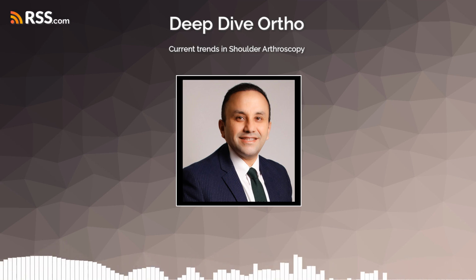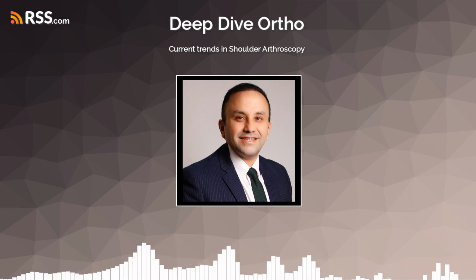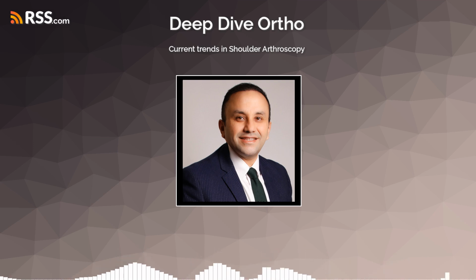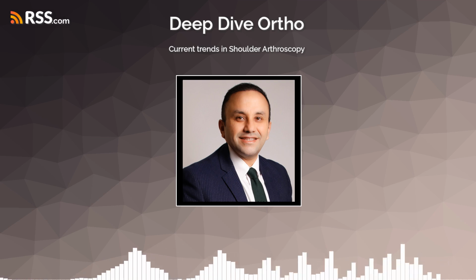A cushion. How does that help? It helps to keep the humeral head centered in the socket, reducing pain and improving function, especially in older patients who still have a good range of motion and a strong deltoid muscle. But it's not suitable for everyone, and it's not a permanent fix.